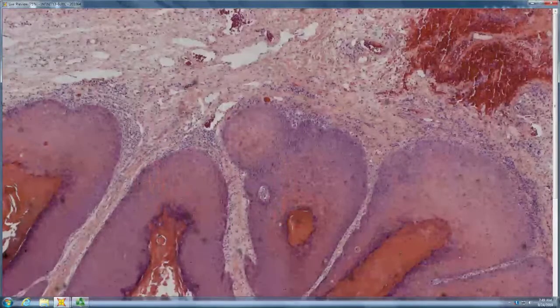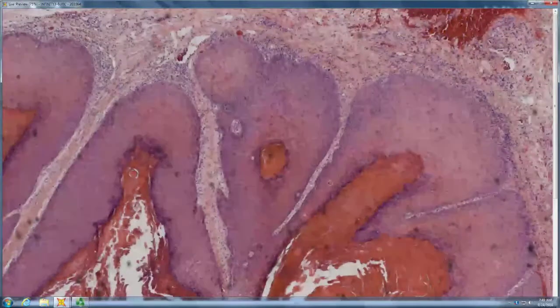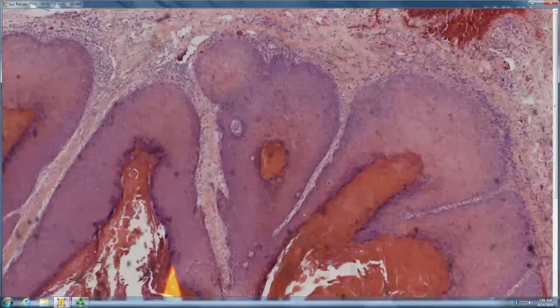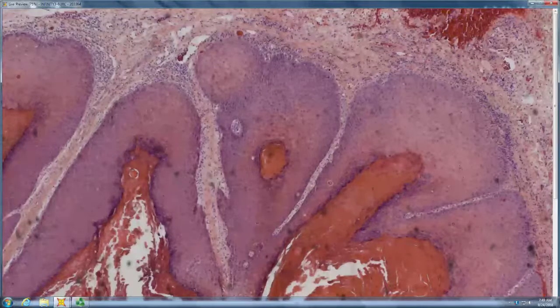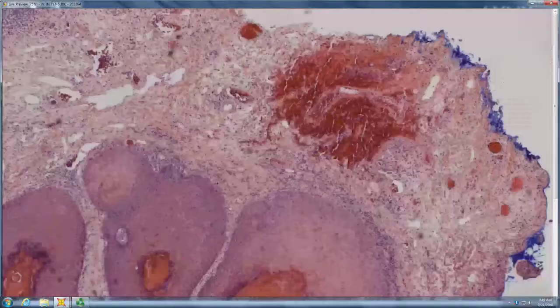I don't see any of the inclusion bodies like a myrmecia. Maybe a KA. Yeah, like early keratoacanthoma, which can be very warty. In fact, there's some evidence that at least some of them are papillomavirus induced. They start with hypergranulosis in the follicles and then start to bud outward with the very glassy proliferation. So early KA sounds pretty good.